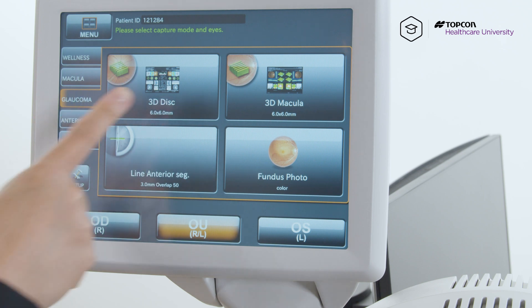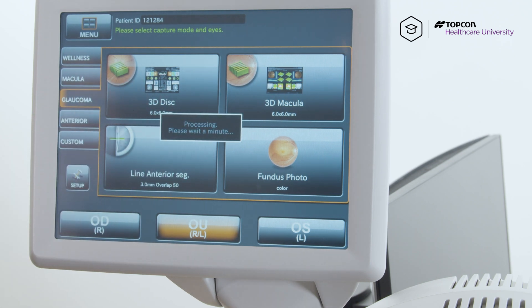Okay, so let's get started. We're going to do 3D disc. Let the patient know to look for the green X, which will be towards their right. So look at your nose.